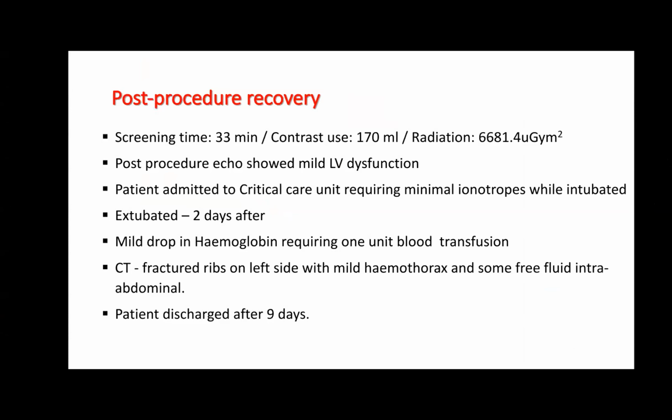So you think in the left main you were in the false lumen, and rather than closing the circumflex, it actually opened. So probably at some stage you just tore the whole flap. The flap, yeah. I think what has happened is they started stenting distally.